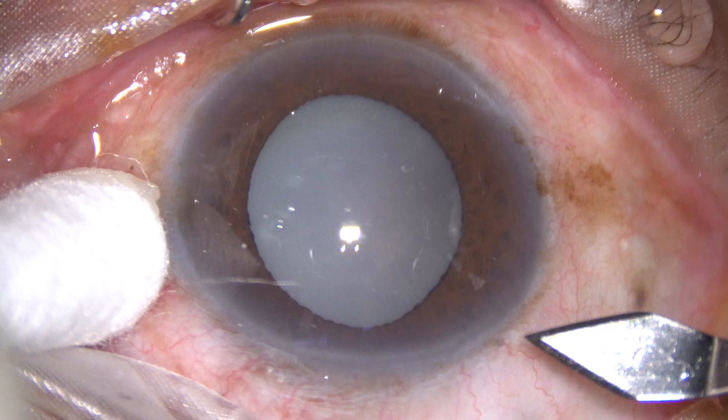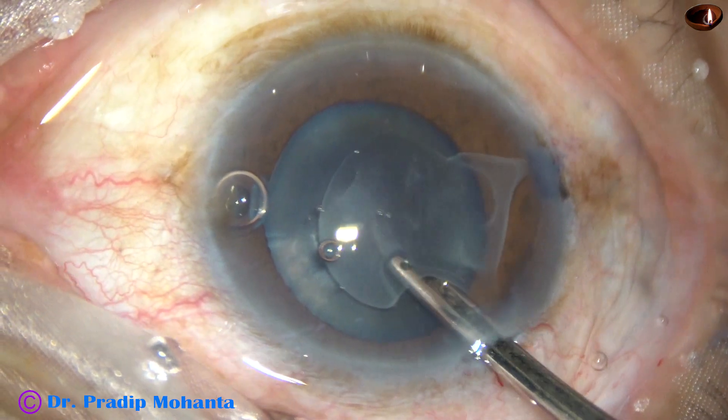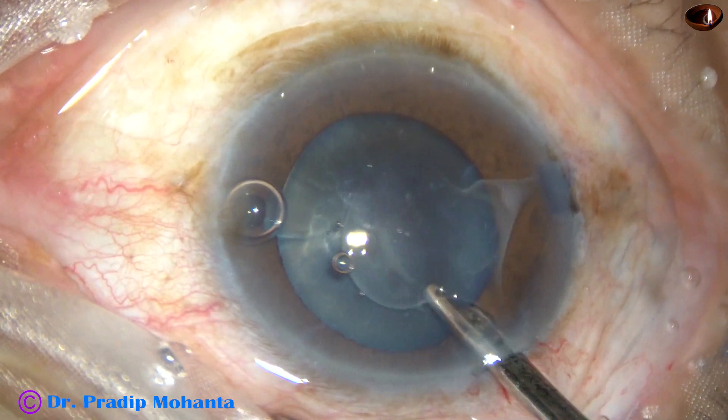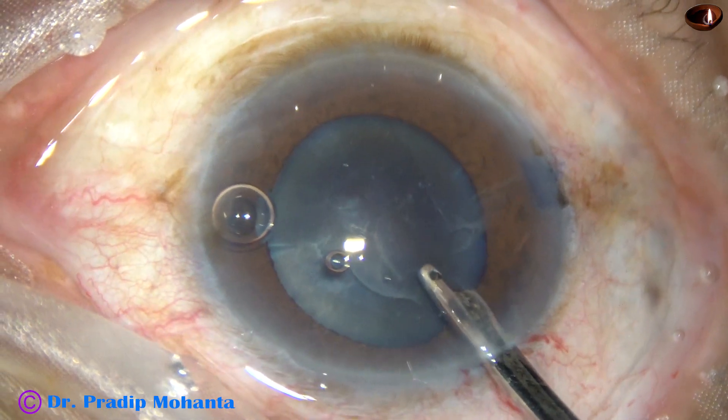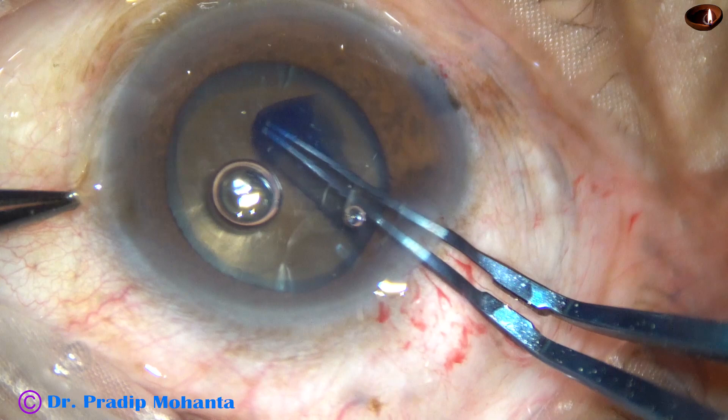This is a hypermature Morgagnian cataract. After making a puncture on the anterior capsule, the milky fluid is aspirated. Since this is a very hard cataract, a large rhexis is done.